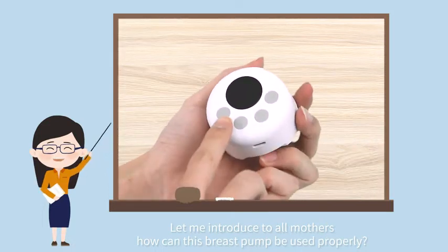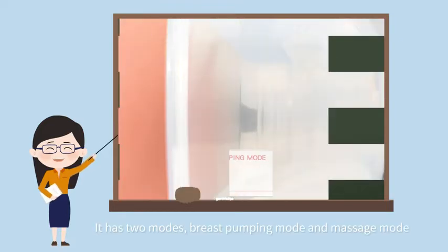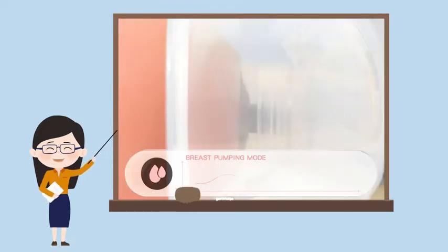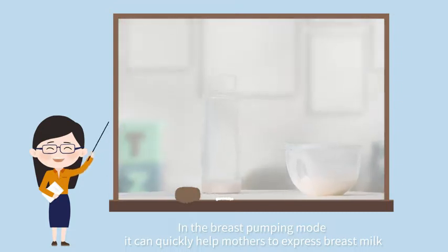Let me introduce to mothers how this breast pump can be used properly. It has two modes: breast pumping mode and massage mode. In the breast pumping mode, it can quickly help mothers express breast milk.